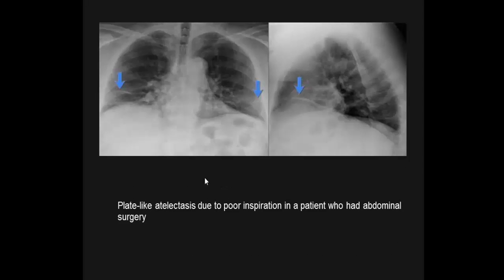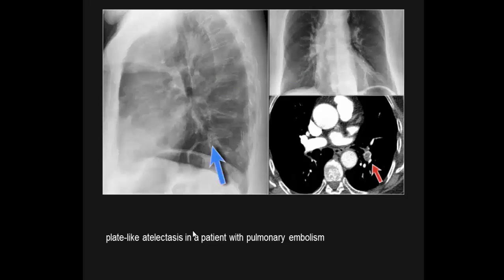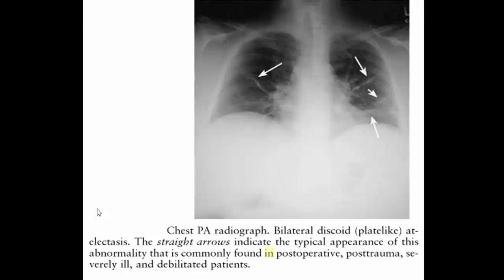Examples of plate-like atelectasis: due to poor inspiration in patients who had abdominal surgery; in a patient with pulmonary embolism; bilateral plate-like atelectasis with straight arrows indicating the typical appearance of this abnormality, commonly found in post-operative, post-trauma, severely ill, and depleted patients.